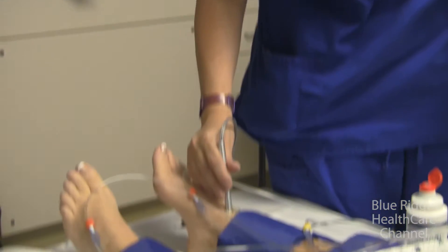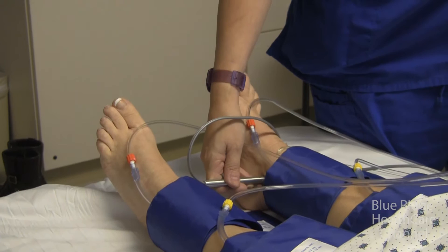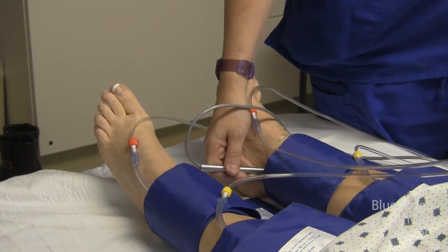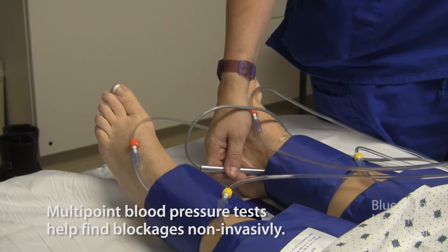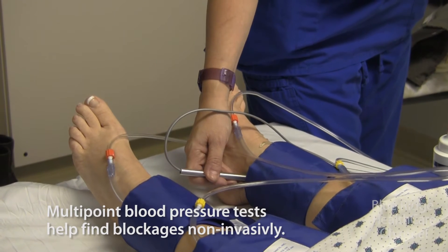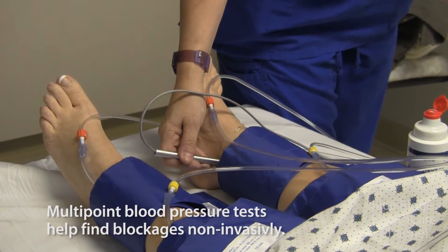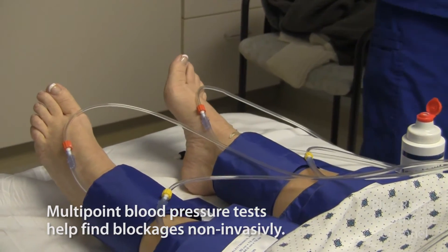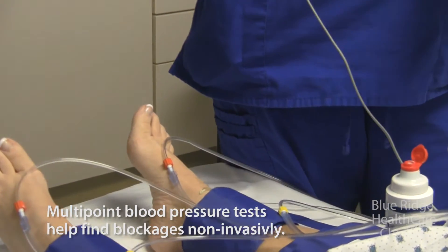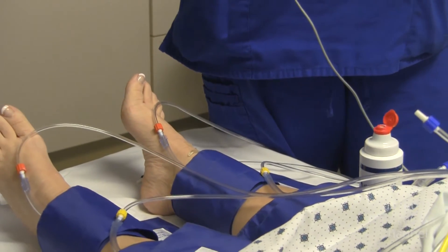So we're going to measure two vessels. That was the dorsalis pedis. There are three arteries that go to the foot — we're also going to measure the posterior tibial artery. We're now inflating the cuff. We write down the numbers for the doctor, and the machine will actually do some of the calculations for you, then the doctor comes and does the final interpretation.